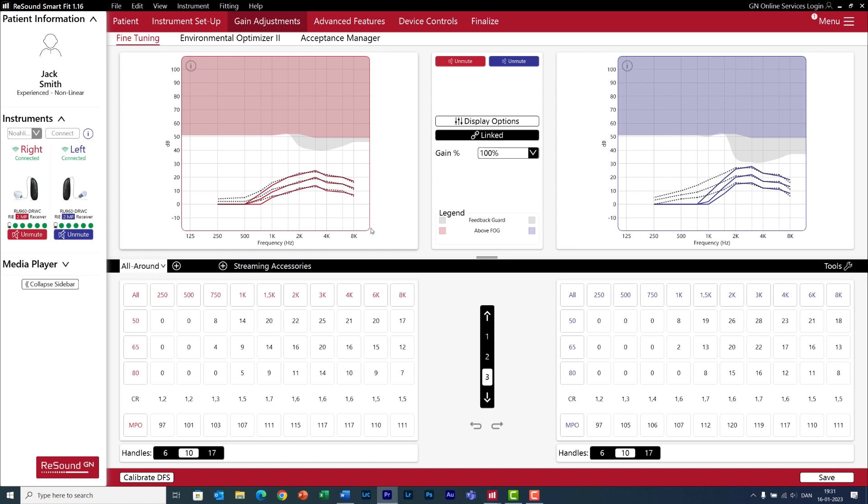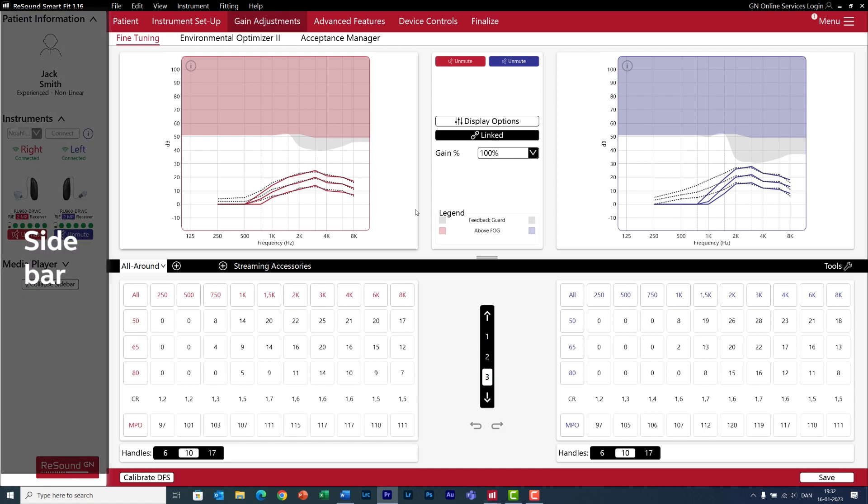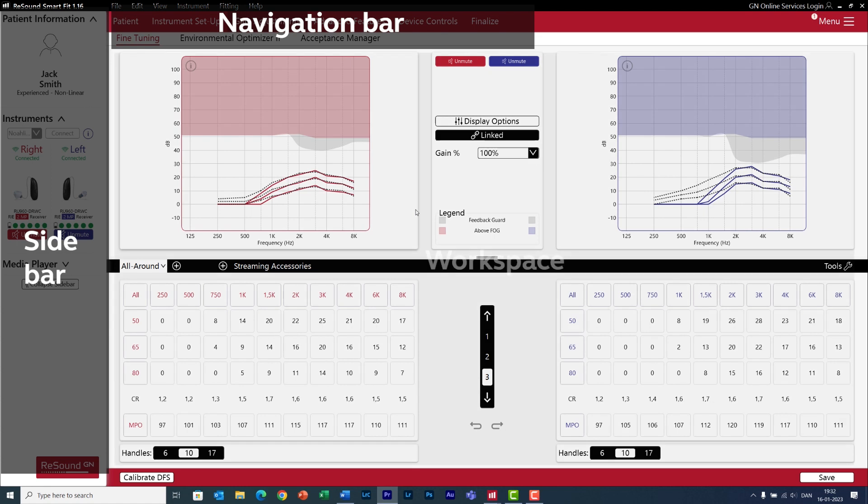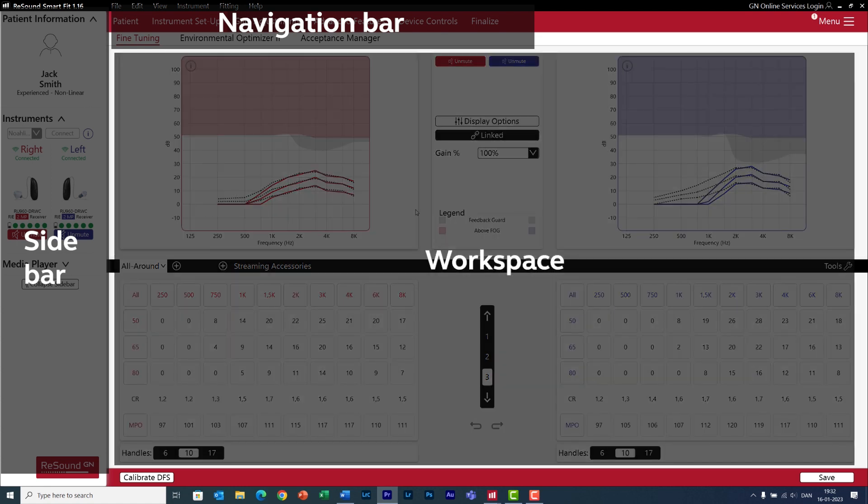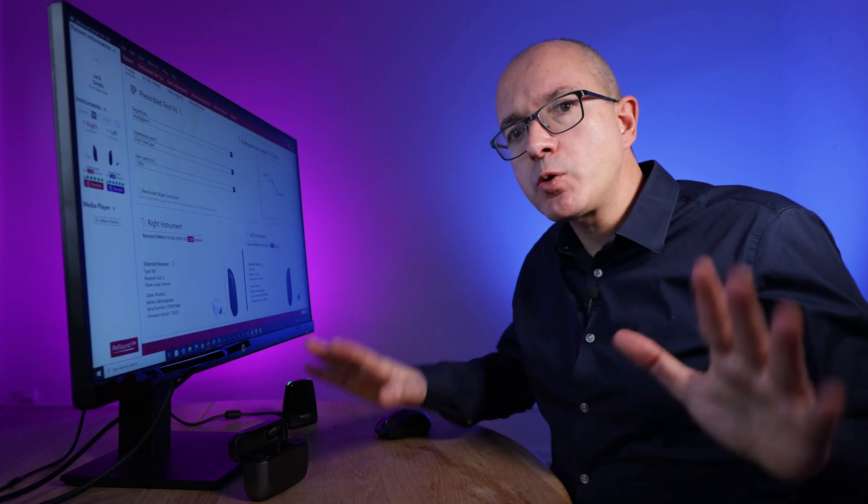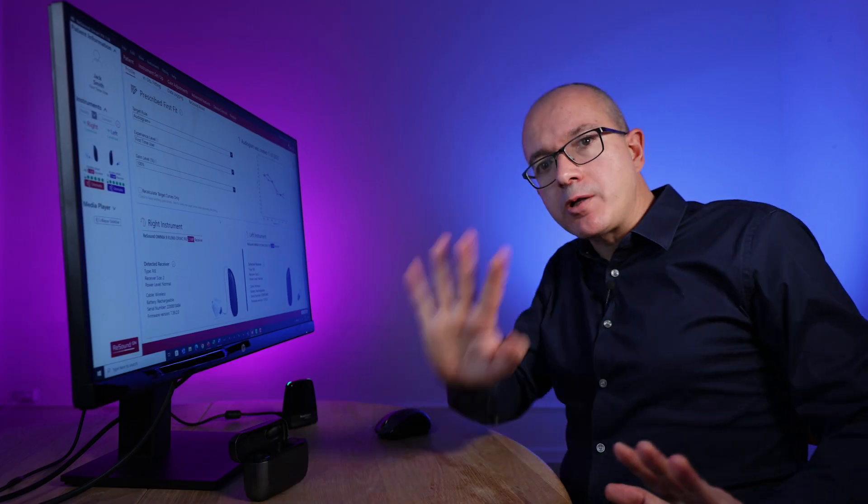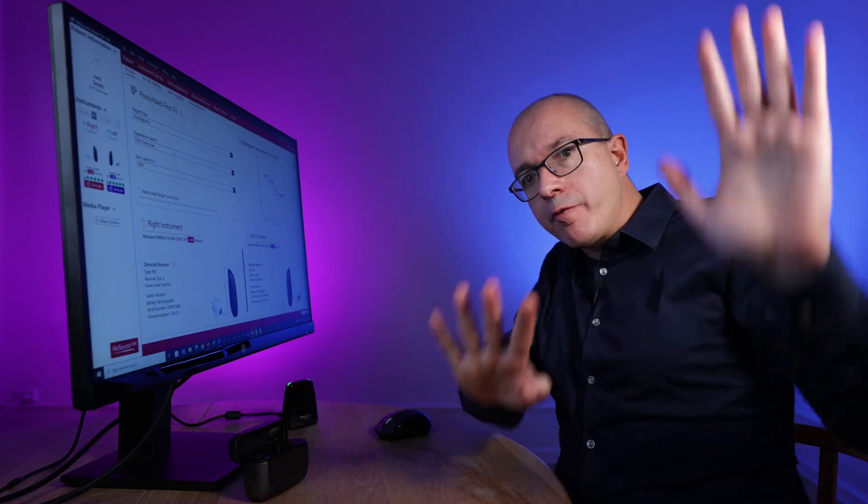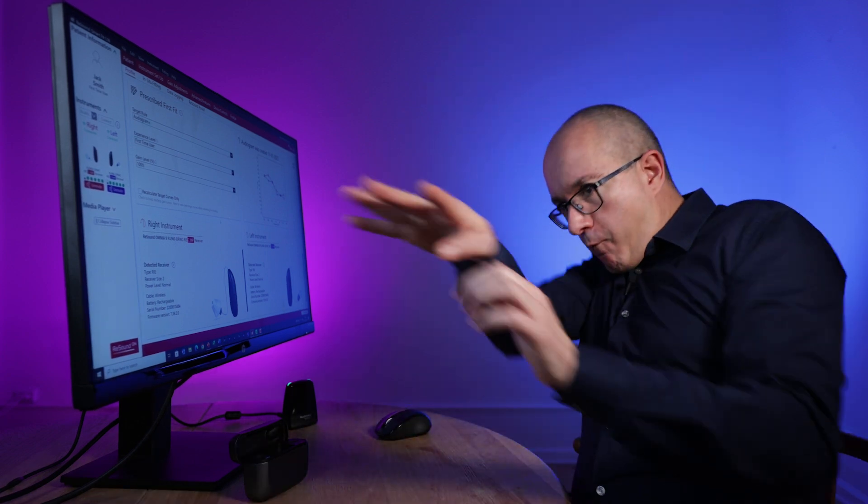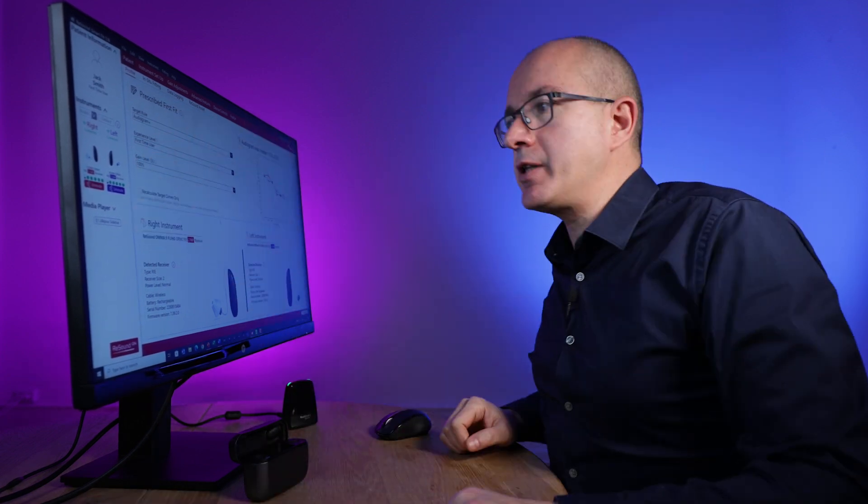This is where you will spend most of the time programming the hearing aids. Again, it consists of three areas: the sidebar, the navigation bar, and the workspace where you can program all the features of the hearing aids. Let's do a little bit of wax on wax off so you become a software ninja.